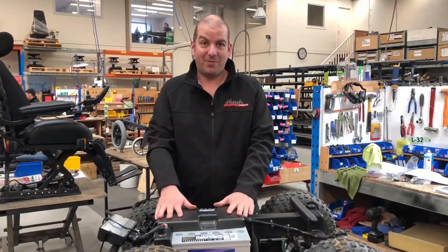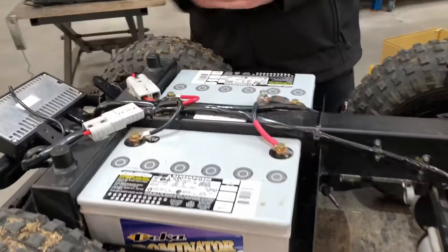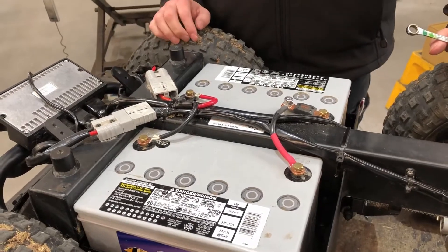Now that we've got our cover off, we remove our battery cover — there are six screws there — and we get access to our terminals. With the terminals, always remove the negative first and put it back on last. That way we avoid any sparking or shorting out of the terminals.